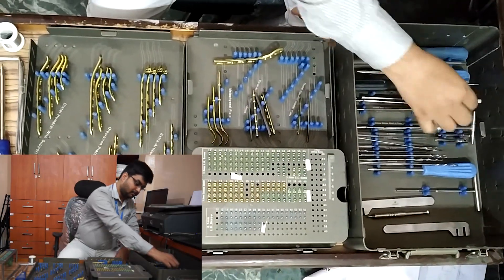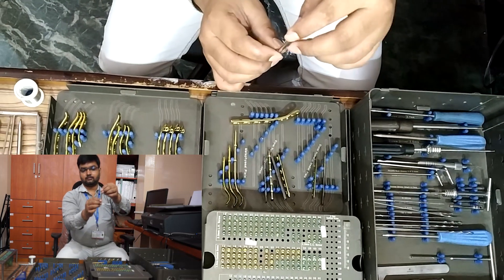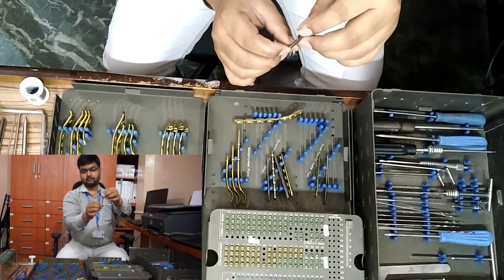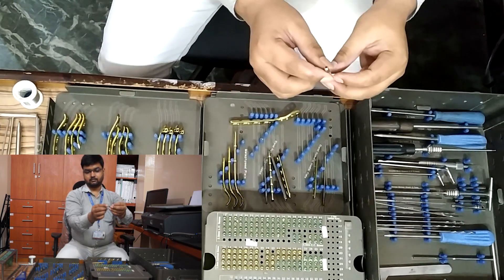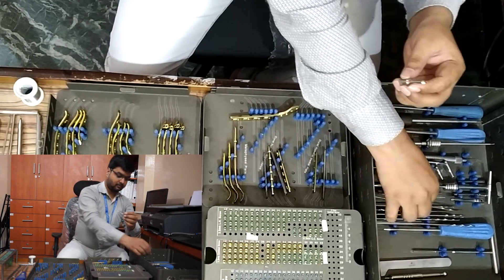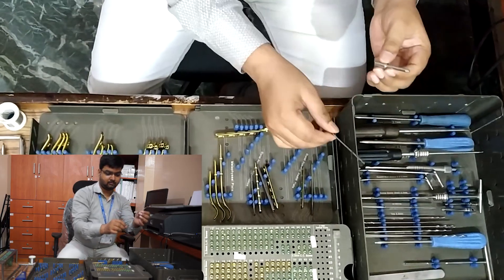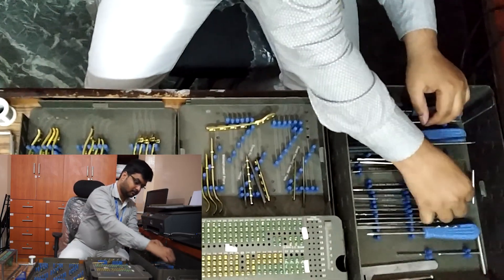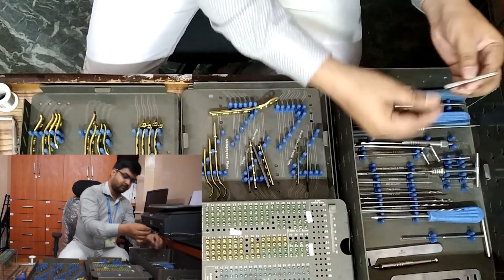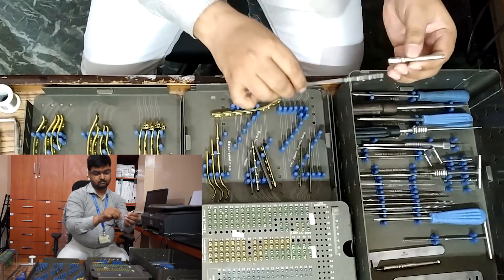Now we are going to show the basic instruments. Drill sleeves: 2.7 mm drill sleeve for 2 mm drill bit, two in number; and 3.5 mm drill sleeve for 2.8 mm drill bit, two in number.